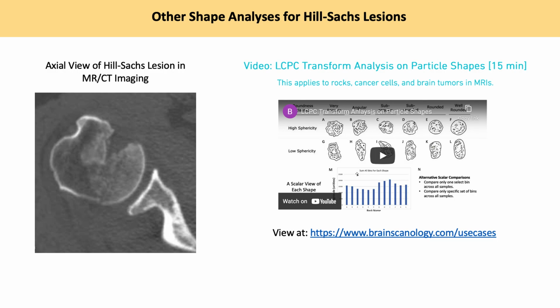And lastly, I just want to point out that since clinicians also view Hill-Sachs lesions in the axial plane in MR and CT images, we can also measure the shape of Hill-Sachs lesions and the humeral head in the axial view.